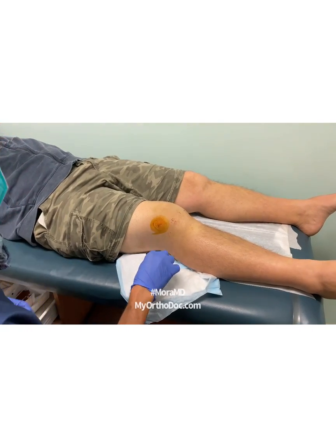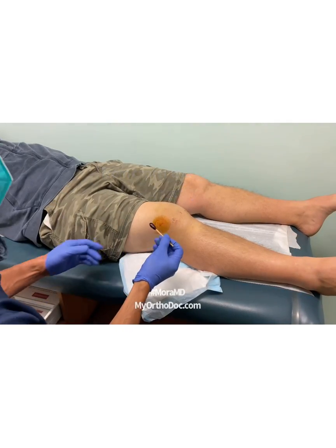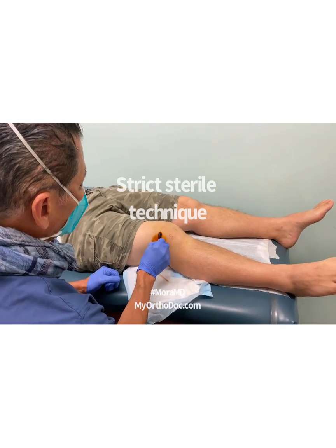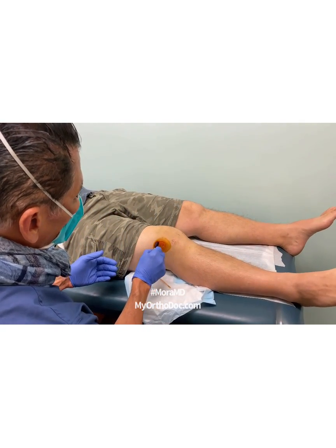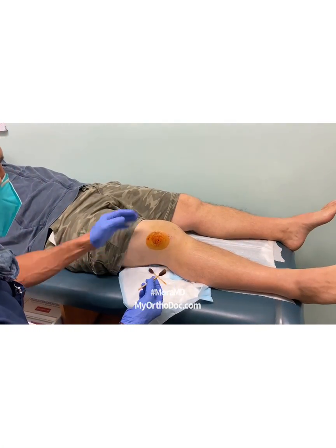A lateral release was done to improve patella mechanics. As occurs in many cases of lateral release, there's post-surgical swelling, and unfortunately sometimes all that swelling slows down the recovery process and it's quite uncomfortable.